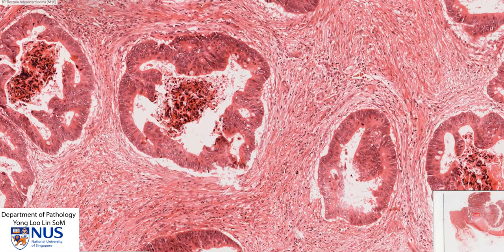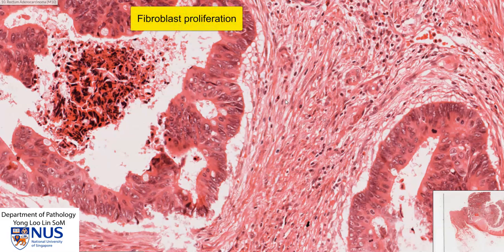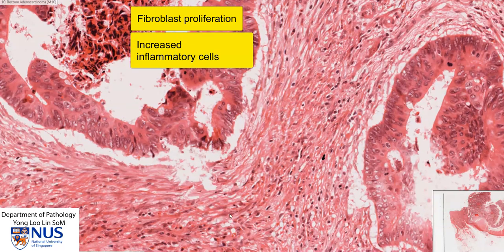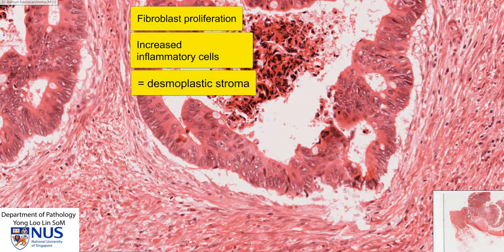The stroma around these invasive neoplastic malignant glands is rather active — it is more cellular than regular submucosa. There are more plump to spindle cells, which are fibroblasts, and there are also inflammatory cells with small nuclei: some are lymphocytes, and there are a few neutrophils as well. The stroma is rather cellular, disturbed, and disrupted. This is known as desmoplastic stroma, and it usually occurs in the context of invasive tumors.